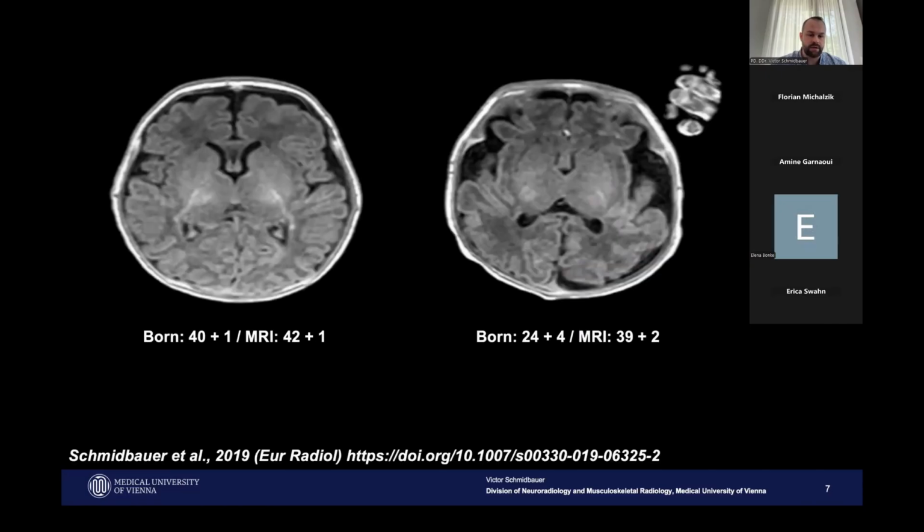So now let's talk about some research aspects. As mentioned, we have a strong focus at our department on fetal imaging and neonatal imaging. Perinatal imaging is one of our focuses. And as mentioned, the first cohort of patients where we integrated the multidynamic multi-echo sequence were neonates. At our institution, it's common practice to image former extremely preterm-born neonates, which means born prior to 28 weeks of gestation, at term equivalent age.